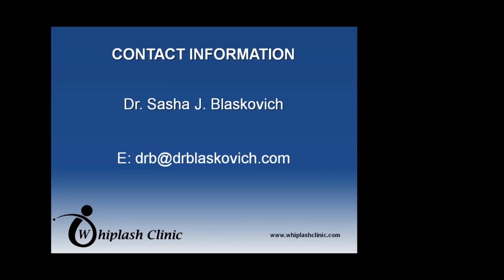Simply because of these findings, because if I didn't notice the static suspicion and then follow that up with a motion X-ray, the patient is a ticking time bomb, and it's a strong contraindication for me to be doing some of the things that I would normally do on a patient that doesn't have that injury. And the only way to discover that is by imaging, and definitely not by going off of the reports, because the reports don't pay attention to these things.